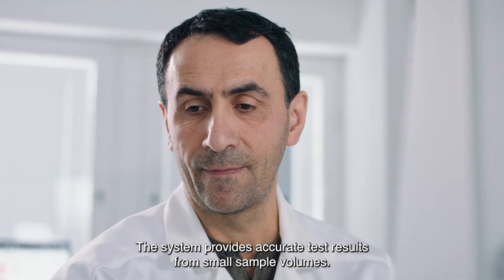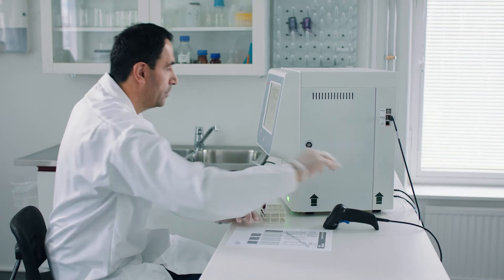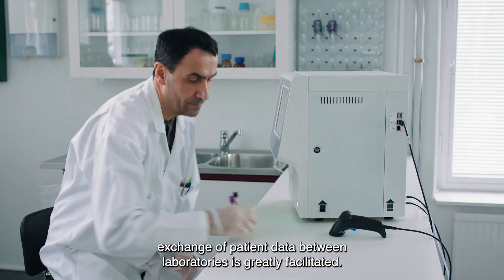The system provides accurate test results from small sample volumes. With a variety of connection options, exchange of patient data between laboratories is greatly facilitated.